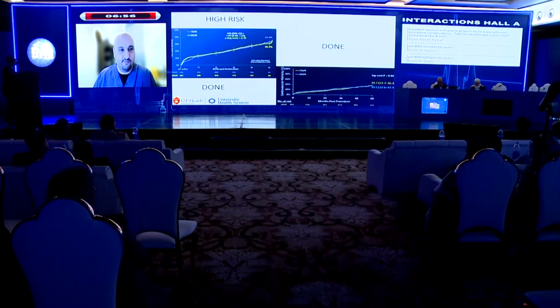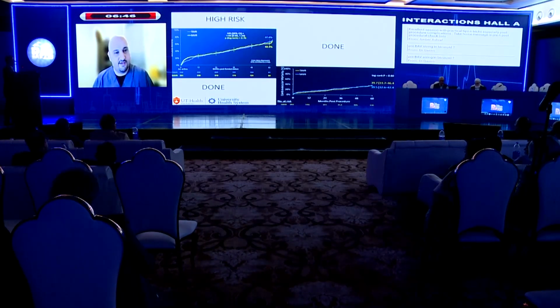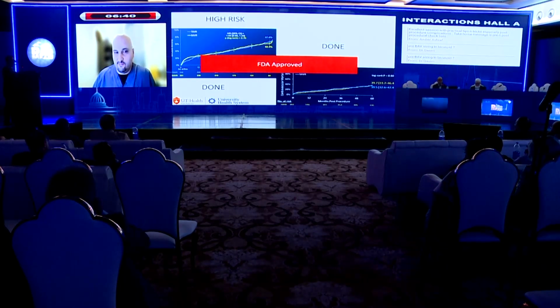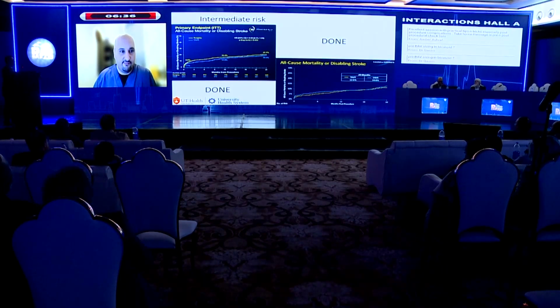Then we moved to the high risk group, one step down toward a little bit lower risk, and they compared that to surgery, and TAVR did as well as surgery in this population. That led to approval in the high risk group. Then we moved to the intermediate risk group, both for the PARTNER trial and the CoreValve trials, comparing TAVR to surgery.